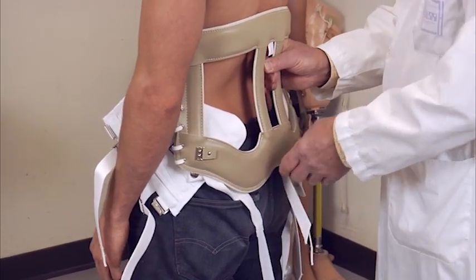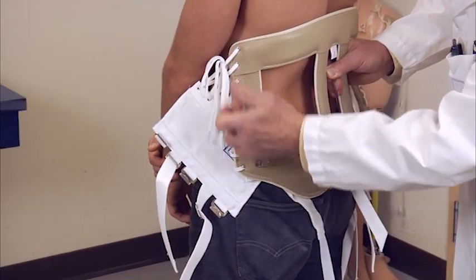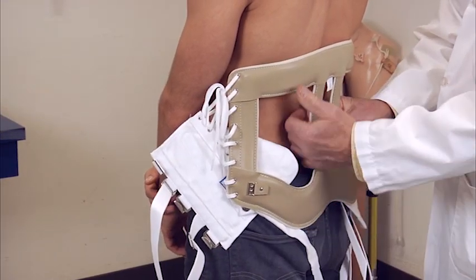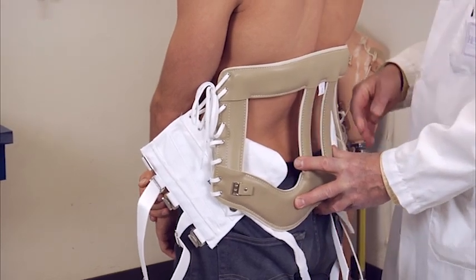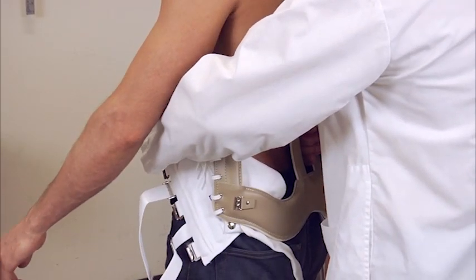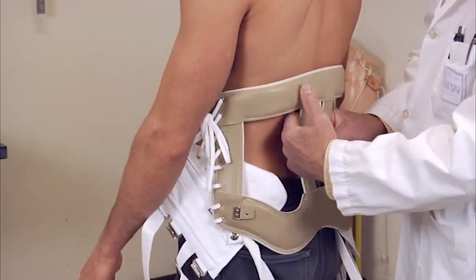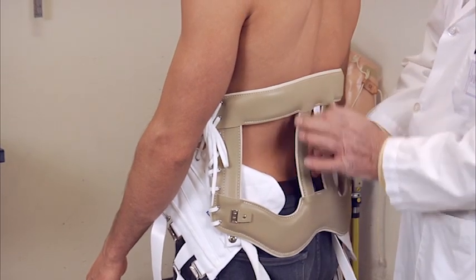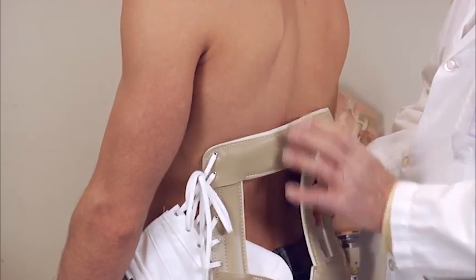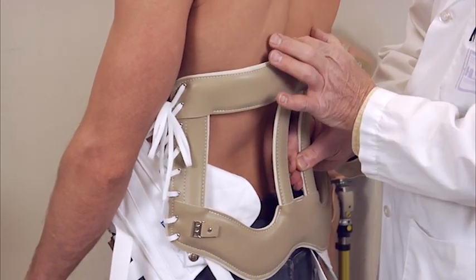On either side, we have lateral stays. These lateral stays should fall along the trochanter midline on both sides. There is a gap here, and the reason for that is when we apply the bib, the bib is going to draw the stomach in like this, forming a rigid cylinder around the spine. We want some place for that back to go. These posterior bars have to go along the paraspinals so that we're not catching the spinous process.